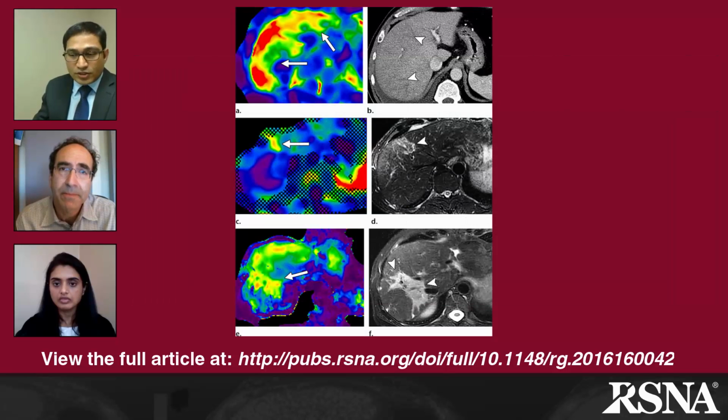Thank you again for the question. Yes, MRE does provide a cross-sectional view of the liver where we perform the elastography. MRE typically is performed with 4 slices, and these 4 slices go through the largest cross-section of the liver, and it gives you a snapshot of a cross-section of the liver, and at the same time the stiffness map will provide you the distribution of the stiffness.